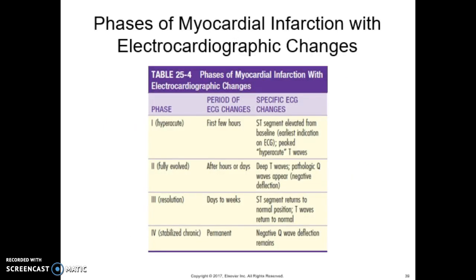Here we see the phases of the myocardial infarction, with the electrocardiograph changes. So go ahead and take a look. This is table 25.4, and take a look at this when you're doing your notes and look more closely at the different phases and the period of ECG changes and the specific ECG changes that go with these phases.